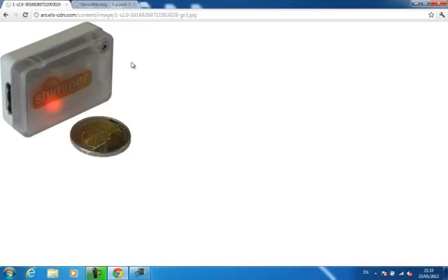The device has a built-in 3-axis accelerometer. In addition, I have attached a 3-axis gyroscope extension board to measure orientation. Together, they provide a 6 degrees of freedom inertial measurement unit.